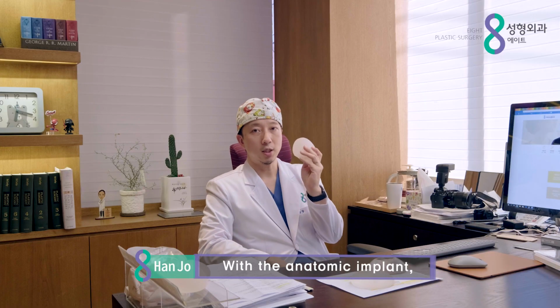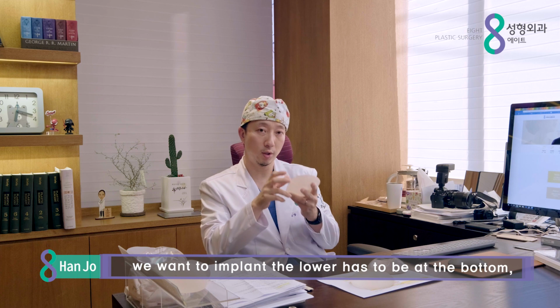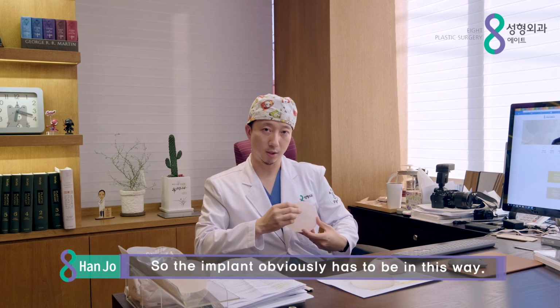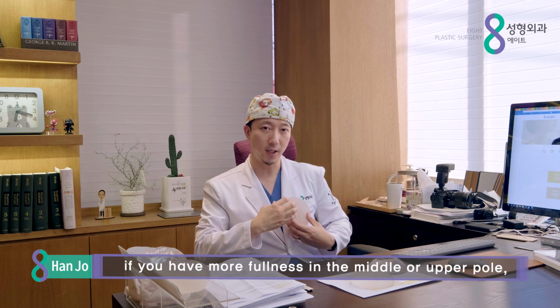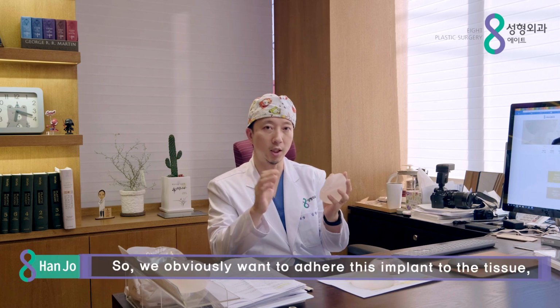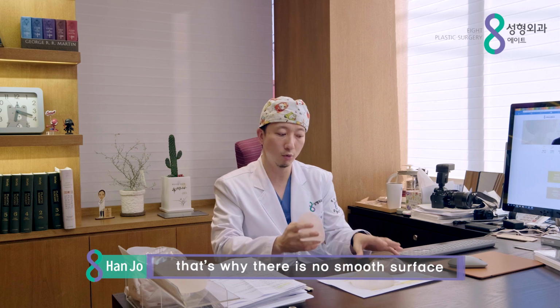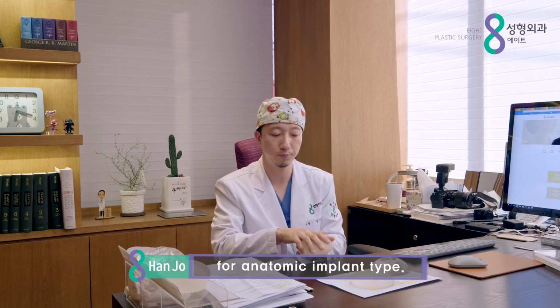With the anatomic implant, we want the implant's lower half to be at the bottom. So there's more fullness in the lower half. So the implant obviously has to go in this way. But with the anatomic implant, if you turn it medially, if you have more fullness in the medial or upper pole, it's not going to look very natural. So we obviously want to adhere this implant to the tissue, and that's why there is no smooth surface implant for the anatomic type. There's only textured.